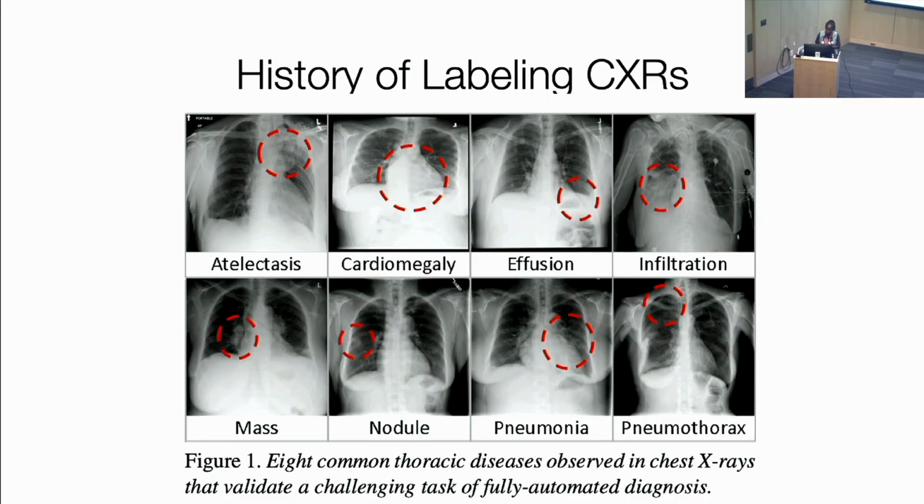But the way they selected these labels, they just asked the radiologist, what should we label our data set? And once that happened, they went to the PAC system. Now I can say PACs, and I hope most of you remember the talk from yesterday. So the PAC system, and pulled, you're just looking at the reports. Sometimes we send Chad on this rabbit hole and say, send me reports with infiltration or pneumonia, something like that. And then you get those reports, and then you now start to apply natural language processing techniques to them.